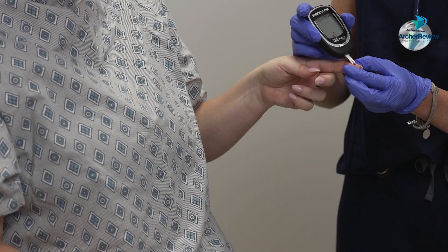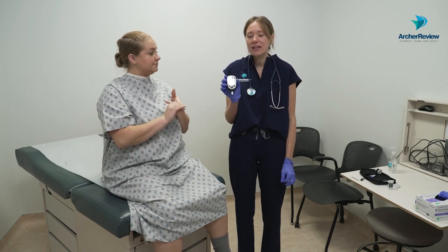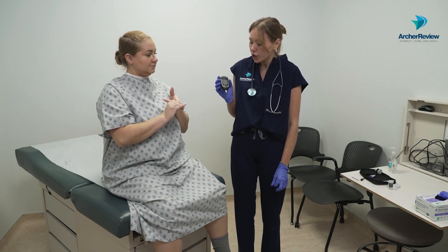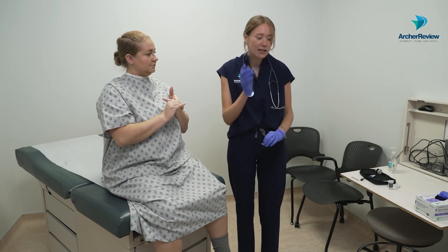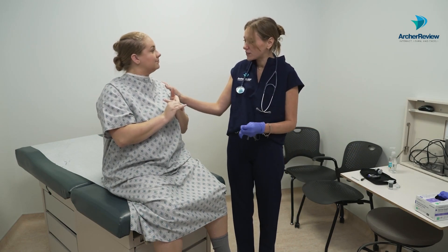We're going to wipe off that first drop of blood, and then that second drop of blood is the blood that you test. Go ahead and stick your glucometer directly on it — it will soak up the blood. Hold that there on the finger and this is going to give you your blood sugar reading. Once it spits out the number, dispose of the strip in a biohazard bin. The reading is 99. Perform your hand hygiene and check in with the client to make sure they feel safe.